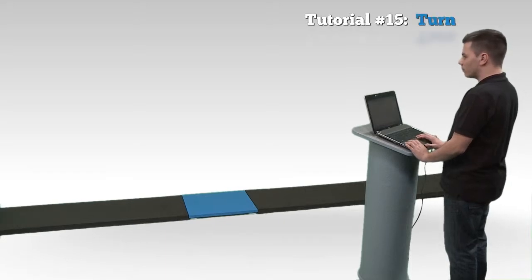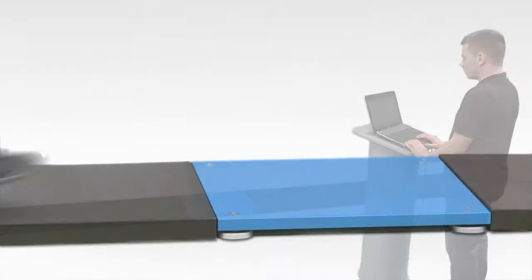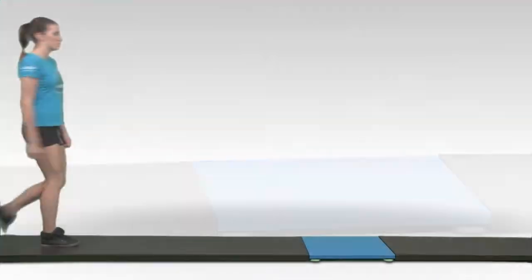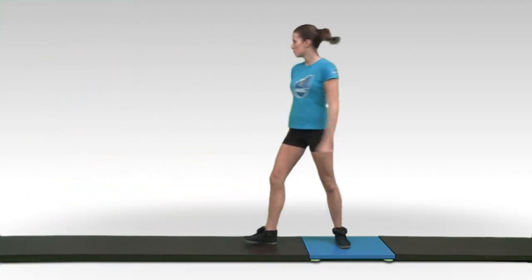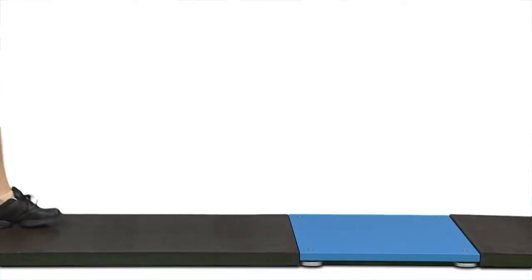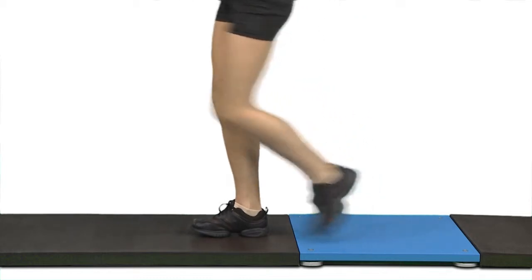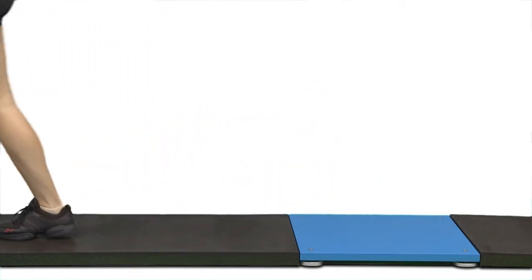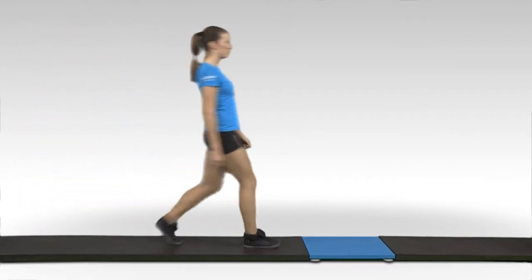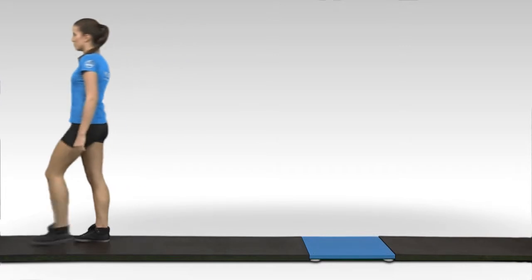Turn is a clinical test where the subject has to make 2 or more forward steps and then turn by 180 degrees. After the turn, the subject walks back to the starting point. The quickness of the act of turning can vary according to the specific assessment goals, but most commonly, you will require a brisk tempo. Based on the ground reaction force, the software calculates the time needed to execute the turn and the sway characteristics of the turn.